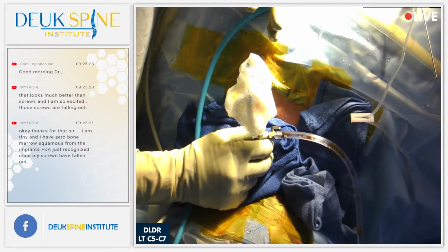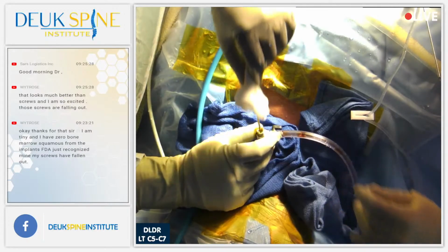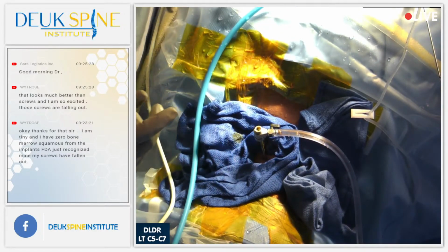My suction's not working here. Come on, we gotta have suction working, guys. All right, let me have some irrigation.